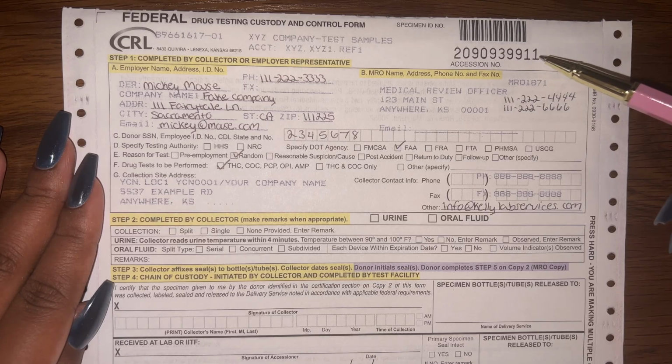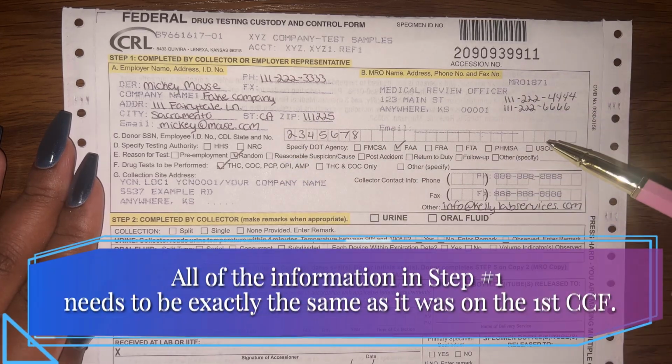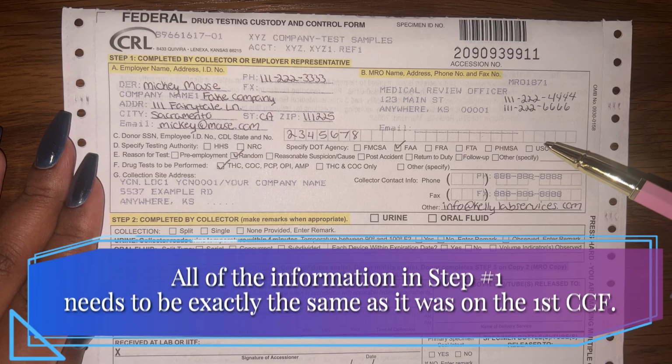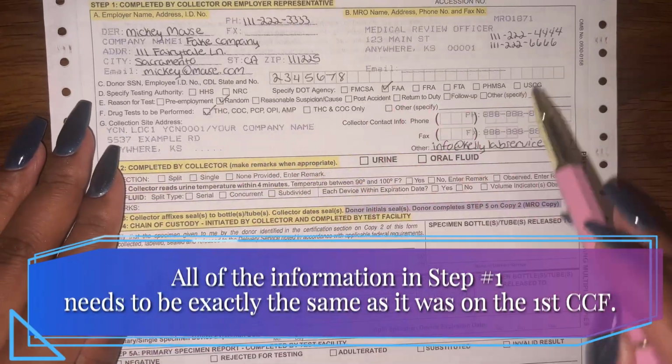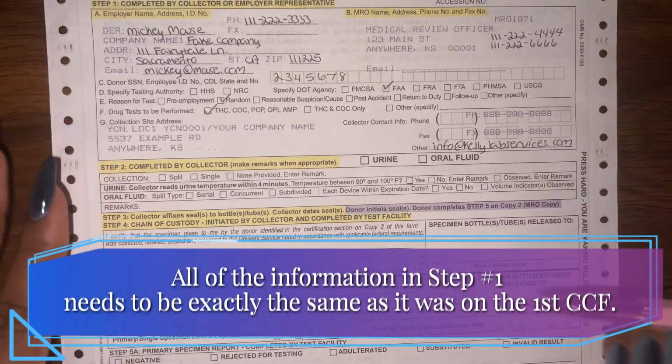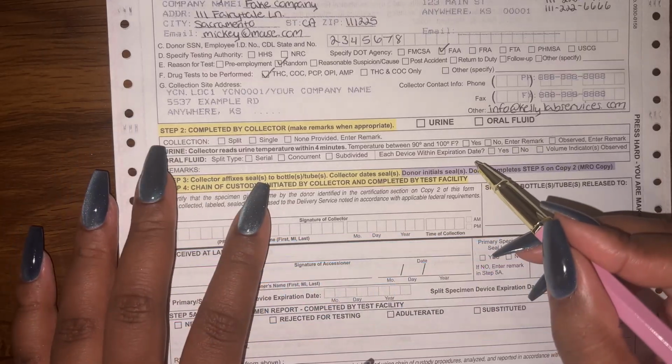You can see the specimen ID number. Everything in step 1 has to be exactly the same as it was in step 1 on your first CCF form when you documented the temp out of range. So all that information is going to stay the same, and then you're going to come down to step 2 and check your boxes and put in your remarks.